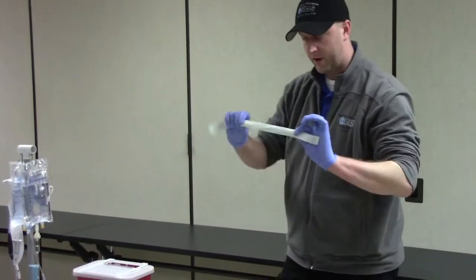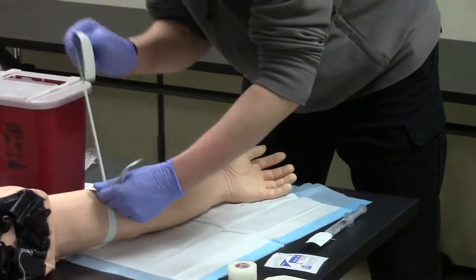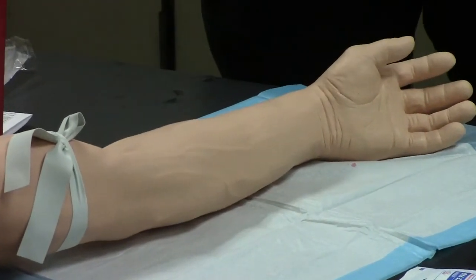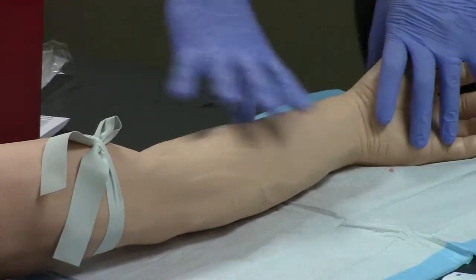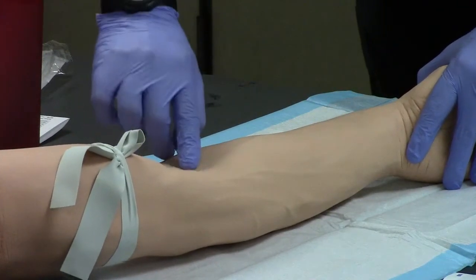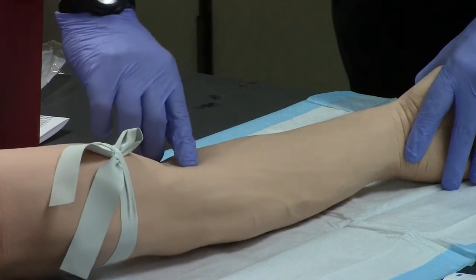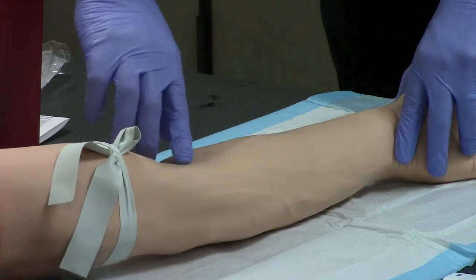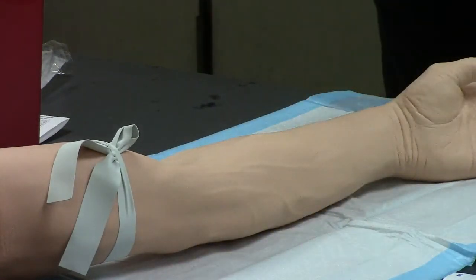Now to actually perform the venipuncture, we're going to grab our constricting band and place it up above the elbow. Make sure it's nice and snug, and we should start to see the veins fill up with blood. We may need to have the patient squeeze their fist a few times to help blood get down there. Once we do that, we want to palpate and feel for an appropriate vein. For today's scenario, I'm looking at an adult patient who needs a bolus of fluid, so we're going to use our 18-gauge catheter and do it in the AC. I've located and palpated my vein, and now I'm going to clean it with my alcohol prep pad.